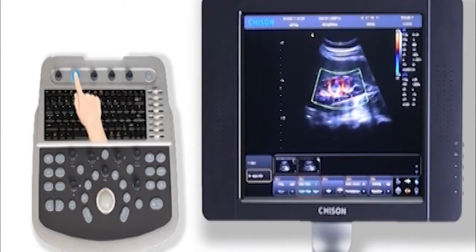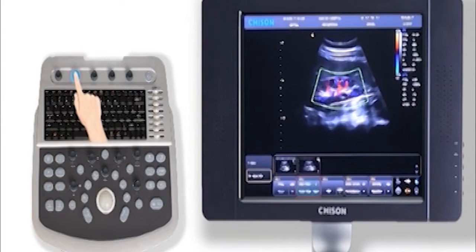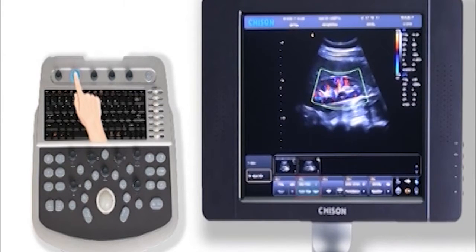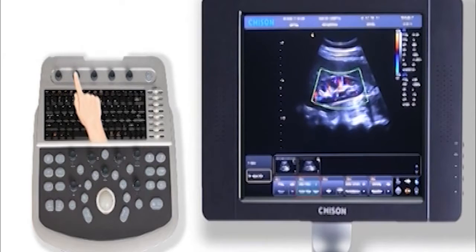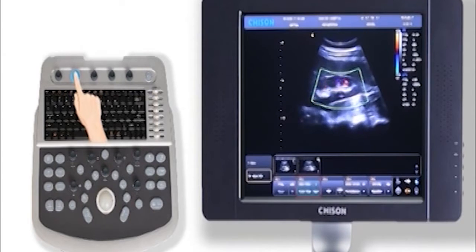Move this key to adjust the wall filter. Get rid of invalid Doppler signals generated by the movements of internal organs.